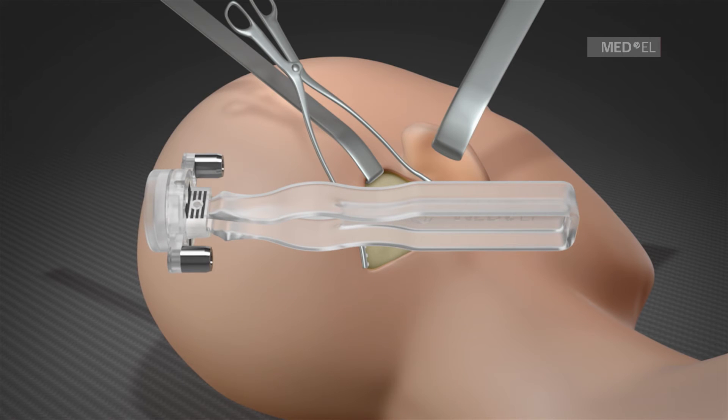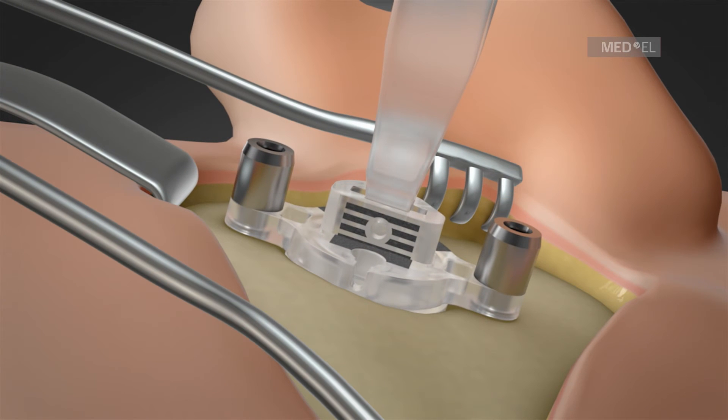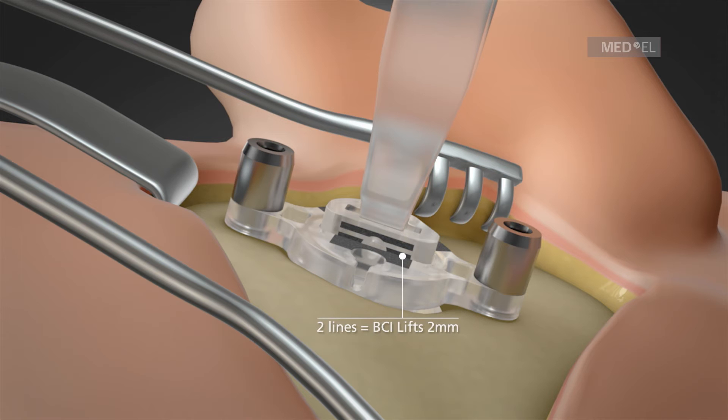A decision can then be made as to whether any BCI lifts are used and if so, which size. For example, if two lines are visible, the two millimeter BCI lifts should be used.